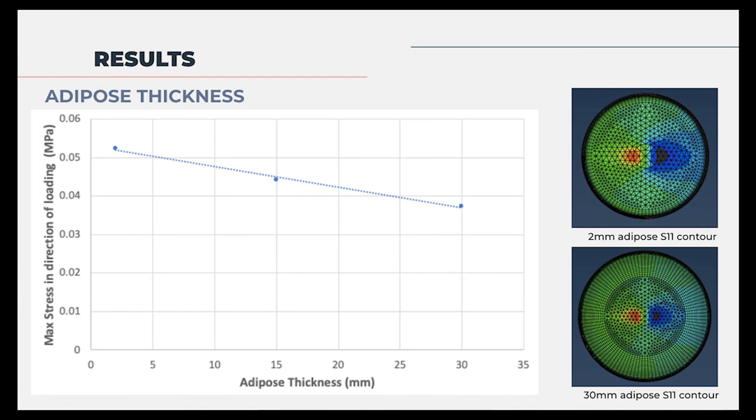Similarly, the effects of the adipose thickness were also investigated. We investigated a thickness range which represented the physiological variation of amputees, documented through the literature. The effect had the same trend as the socket liner, however, interestingly, increasing the adipose thickness proved to be nearly 5 times as effective at reducing the maximum stress than the liner. This implies that the effectiveness could be improved by incorporating a hyperelastic element, as the adipose tissue does, suggesting that a silicone or bio-based material may be a more advantageous choice than the simpler foam that we modelled, and that they should be the subject of any further testing we complete.